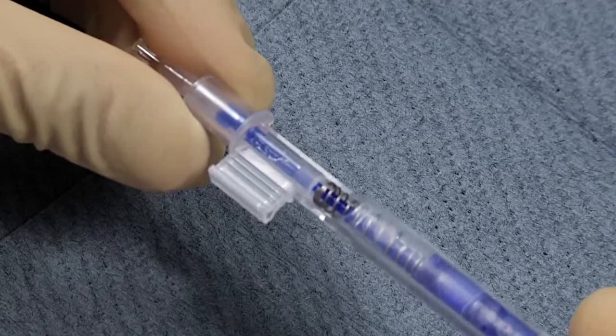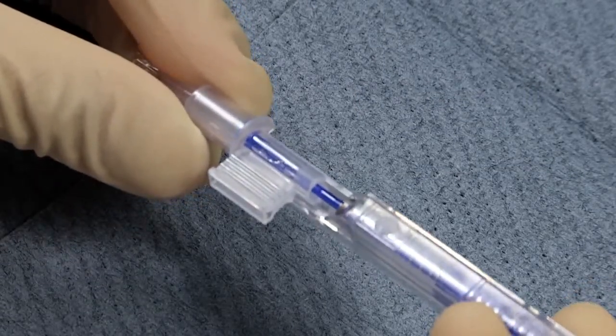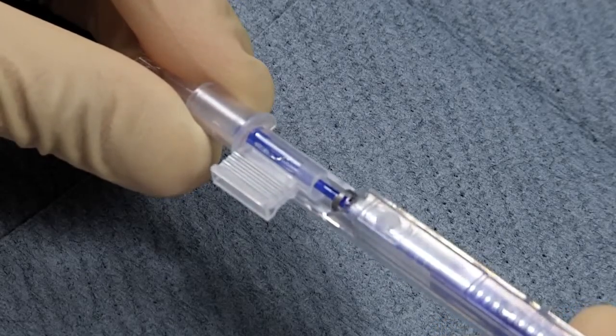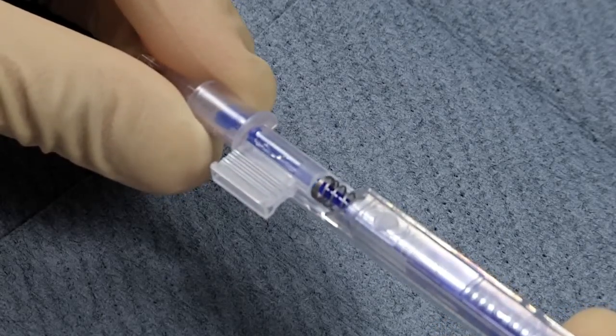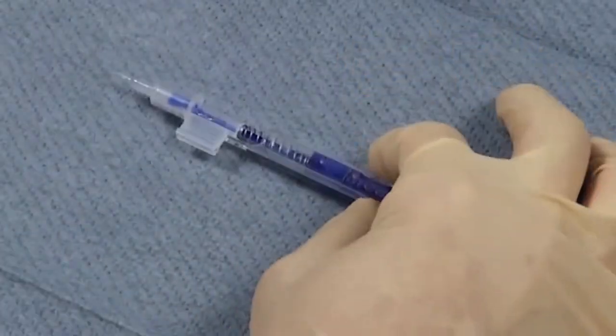Now pull the plunger back sufficiently to visually confirm that the lens remains in the conical tip, and then push forward again. This step also ensures that the trailing haptic is not trapped under the plunger tip. The lens is now loaded and ready for injection.